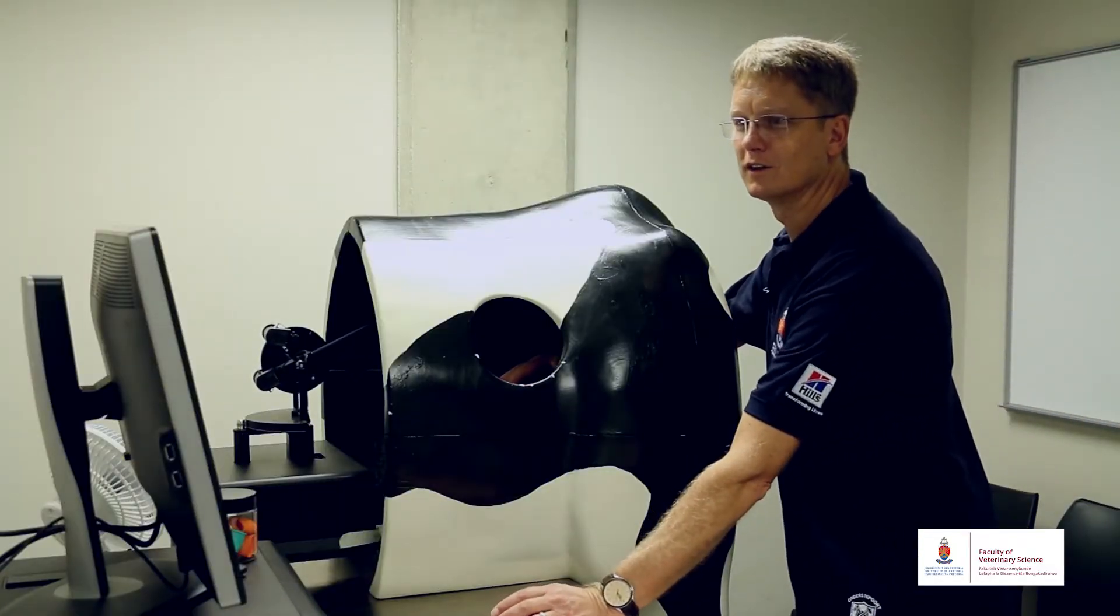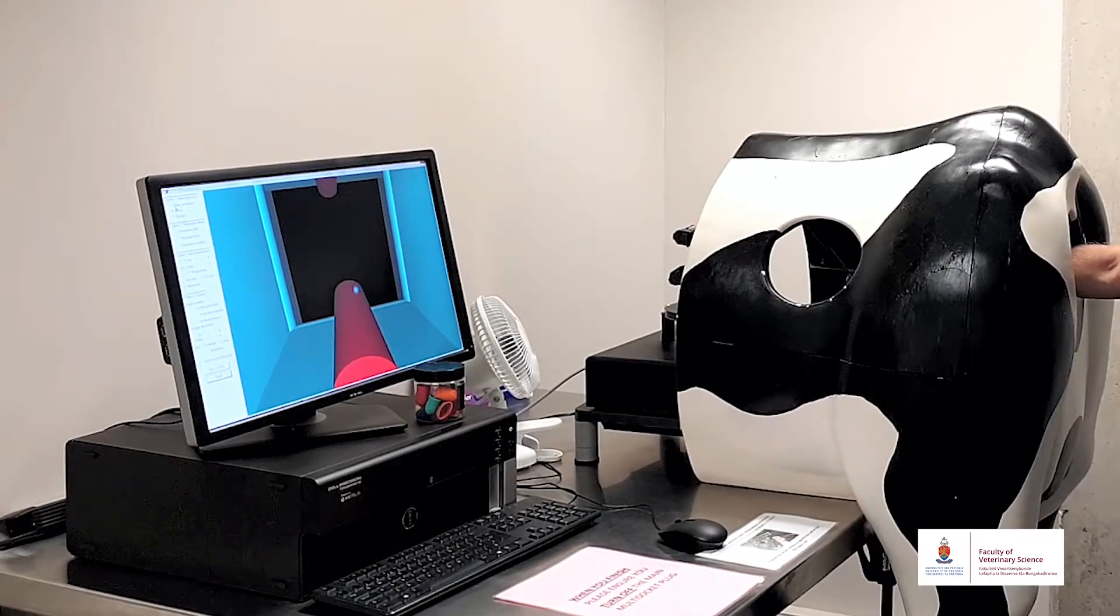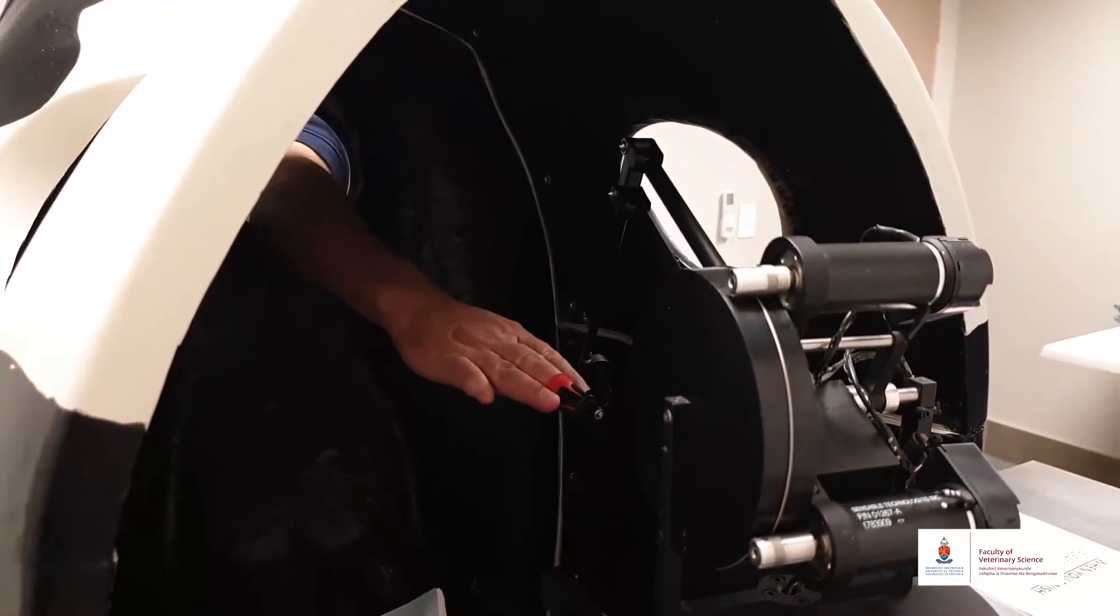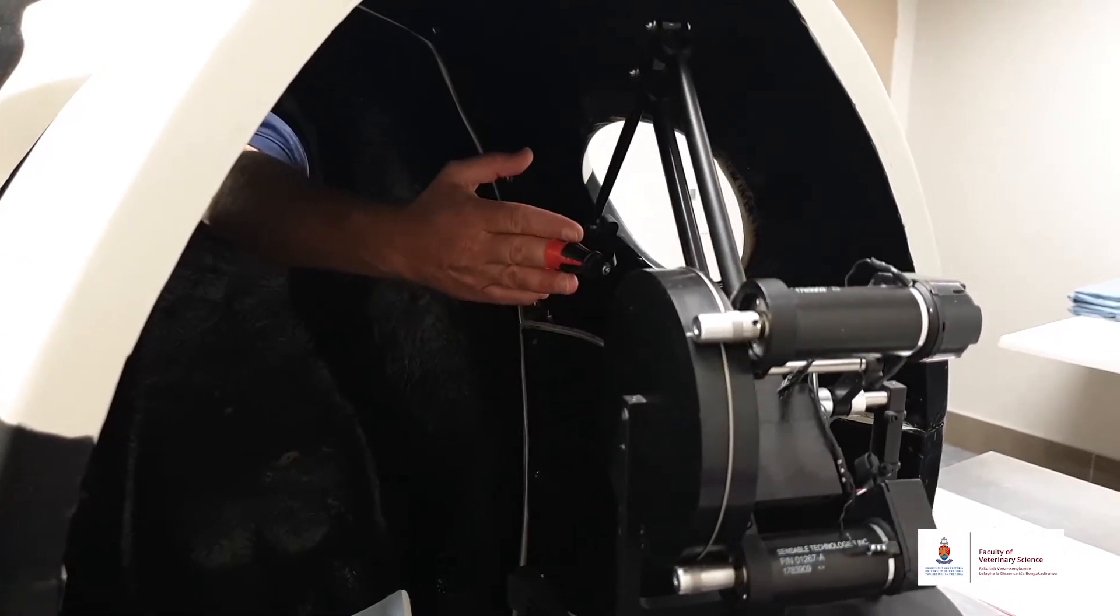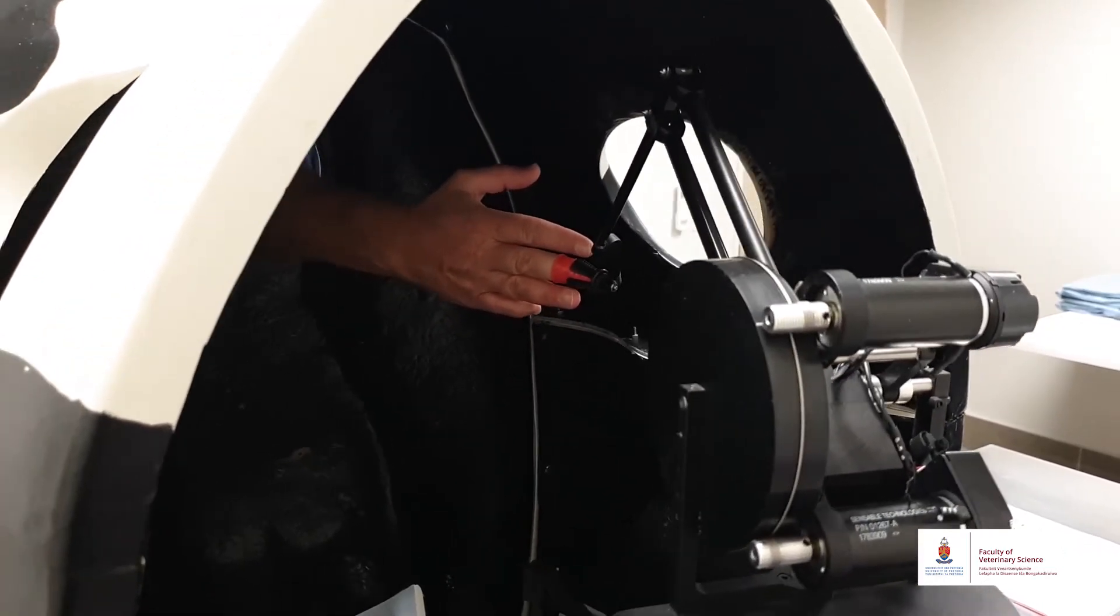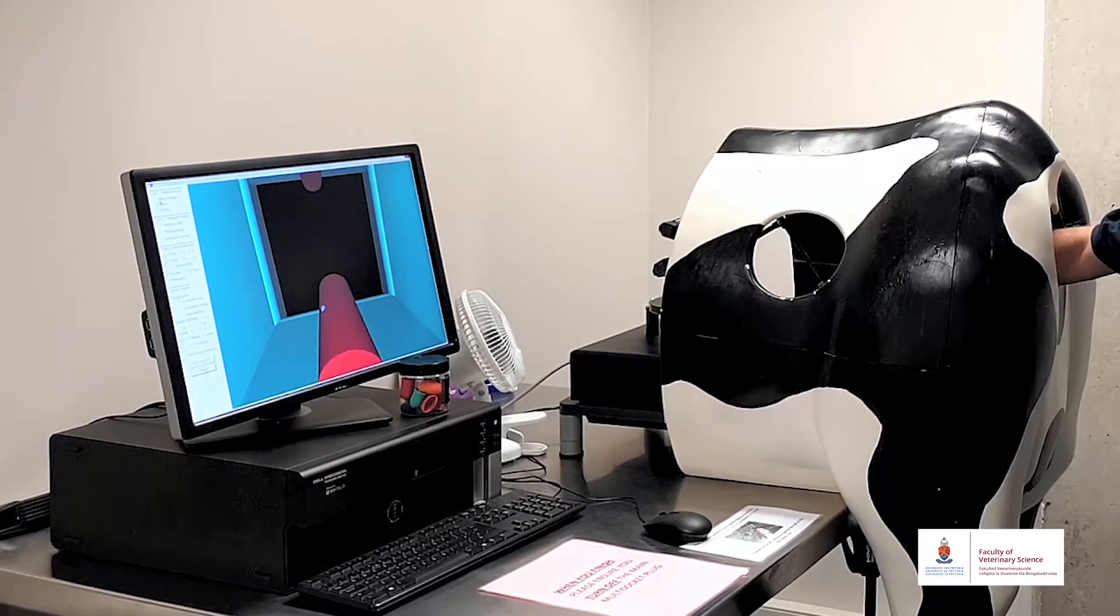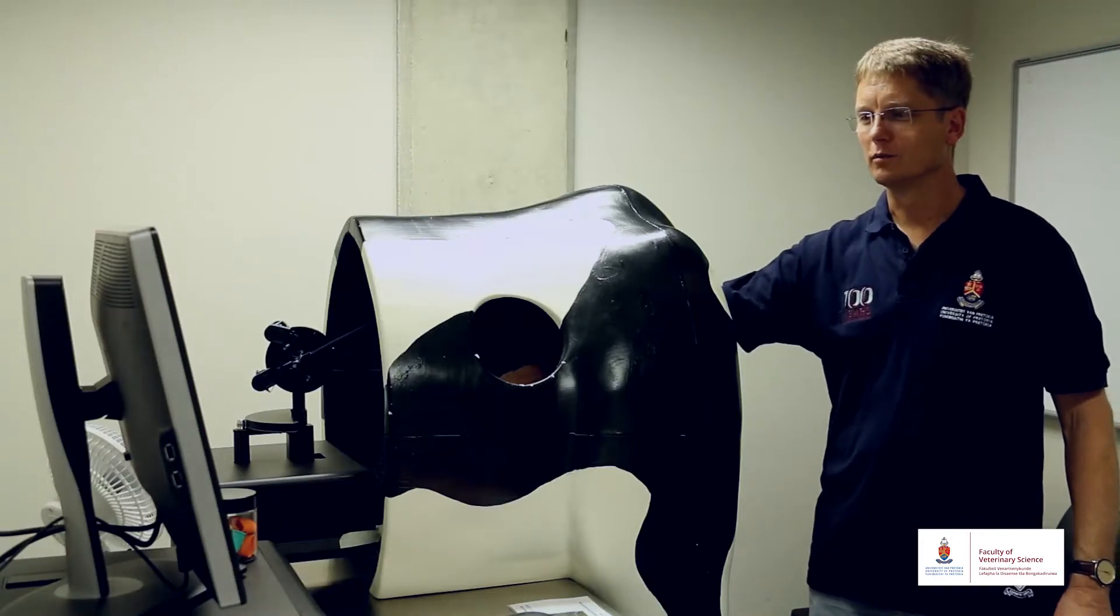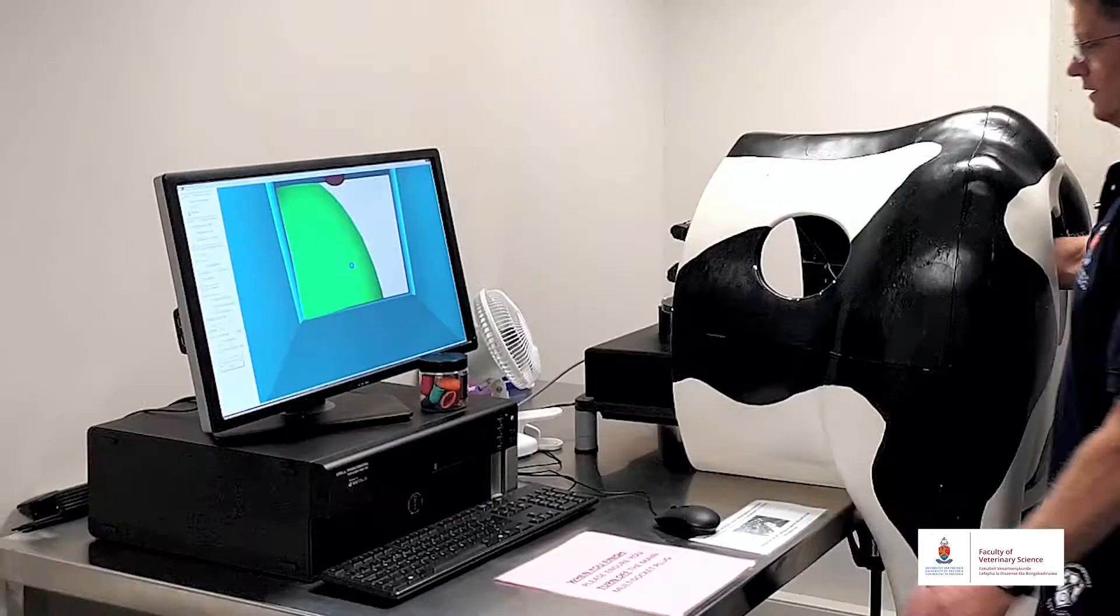Then I go to the next level here which is the cervix, the start of the female reproductive tract. Now the machine will guide my hand and will teach me where the cervix is in relation to the pelvis of the animal. When I go to a real animal I've already familiarized myself with where to find the structures.